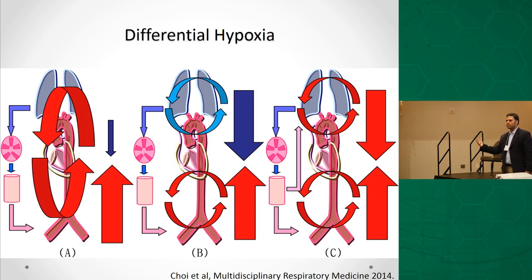So our surgeons here decided to put a venous cannula, which is usually a longer cannula as opposed to an arterial cannula, into the artery and placed it really high up near the diaphragm. The idea was they could push blood directly in there. That particular patient, by the way, was not ready to be weaned. That's why they did this.